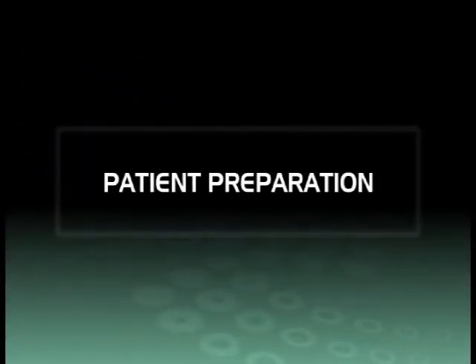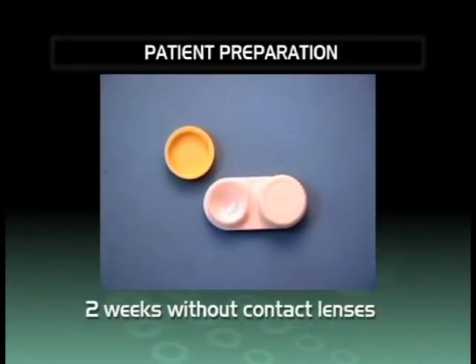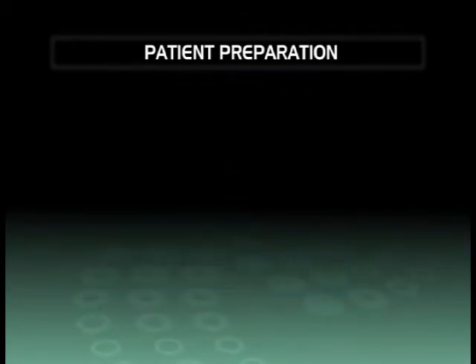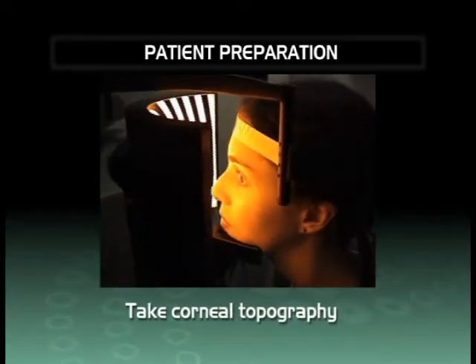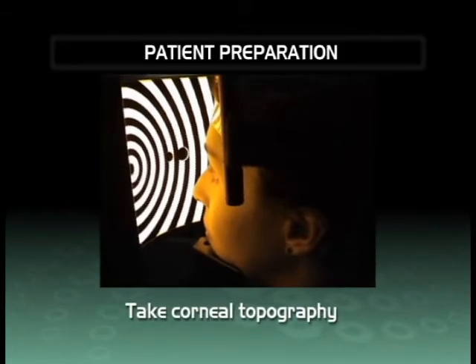Patient preparation. Contact lens wear should be discontinued 2 weeks prior to the last preoperative examination. Corneal topography is an essential part of the preoperative preparation. Any corneal topographer may be used. Prefer axial topography maps.